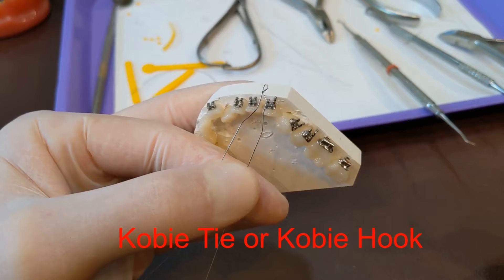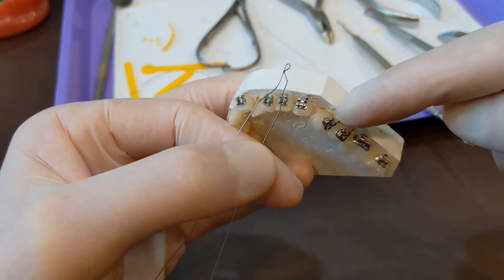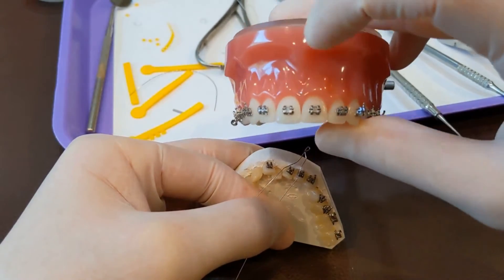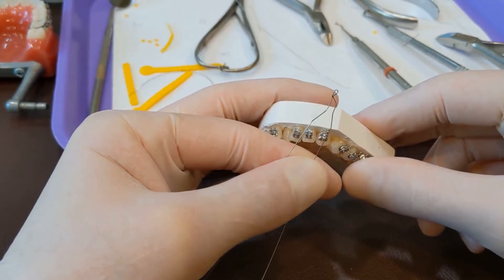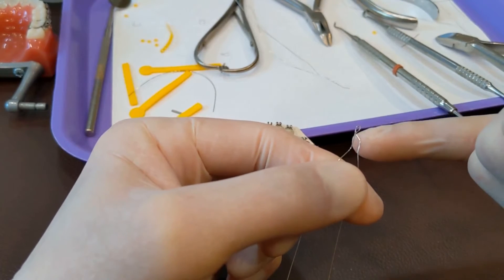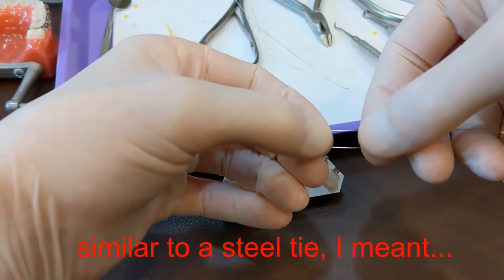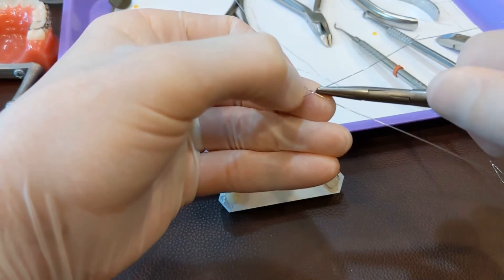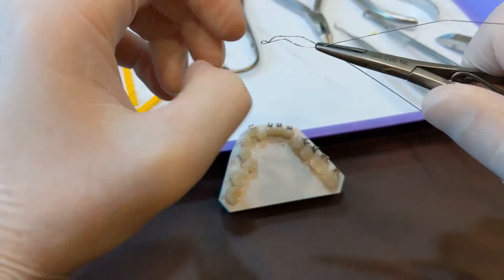This is a Kobie tie or a Kobie hook. Some of the brackets have posts for putting elastics on, but these anterior brackets do not have posts — these front brackets don't have any posts on them. If we need a post, that's what these Kobie ties or Kobie hooks are for. They're similar to a steel tie except they have this little loop — a little solder or tack weld that makes this loop at the end, which is the little hook. Similar to an O-tie, you pinch them with your finger, double these ends over just like that, and with a closed mathieu, grab a hold right where they intersect.